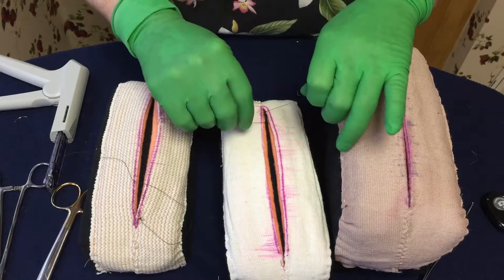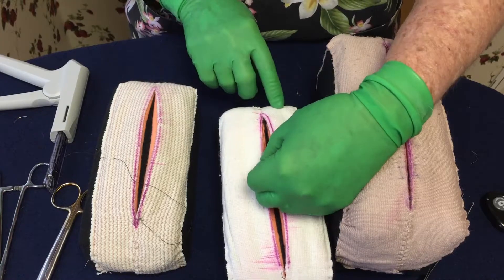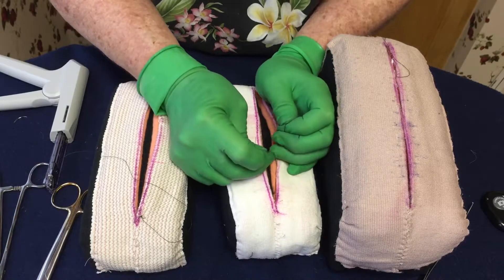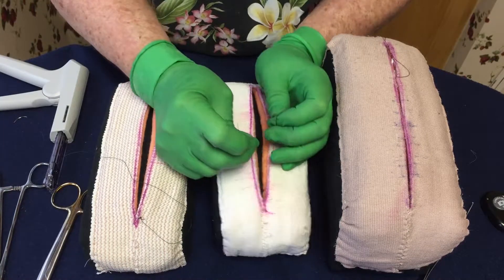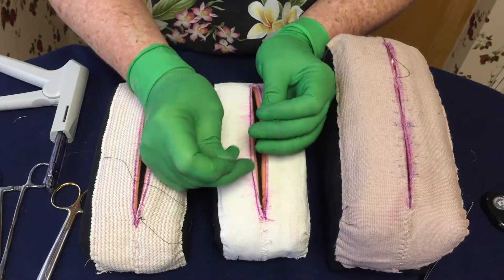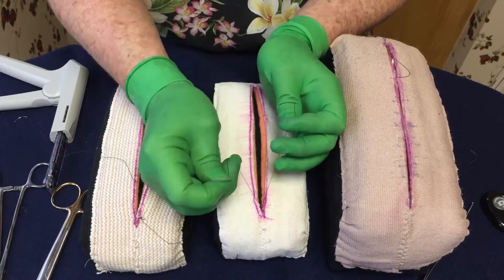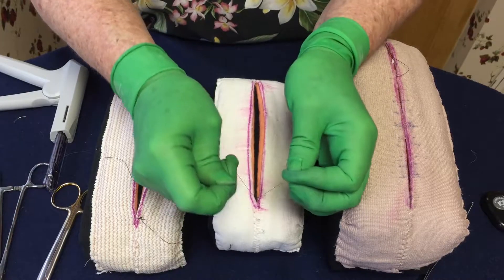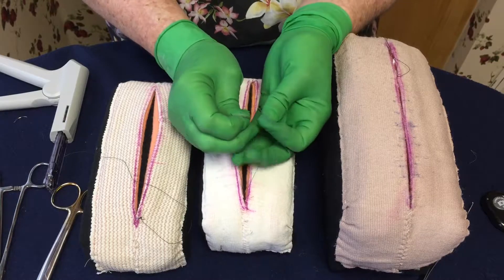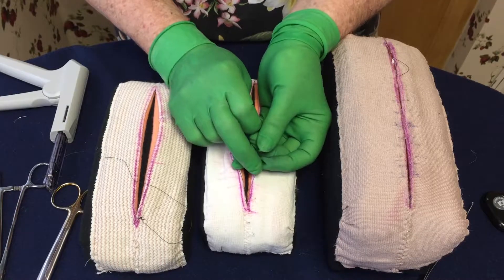When you're doing a trocar incision and you're going to tie it down, if you take and pull it like this, see how it pulls the edges together? This is actually something I learned from the residents I work with — I'm always looking for ways to improve. You can see how it's going to lay, and if it's not going to lay nice, you can take it out and do it again. Pull it down parallel — it doesn't work if you pull up, see how it doesn't really close. But when you pull down parallel, it closes, and then you can tie it that way.